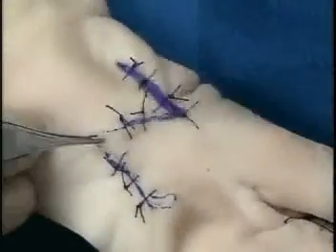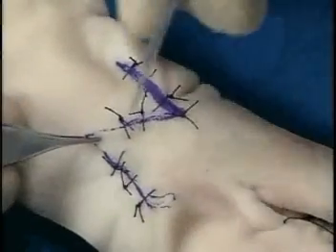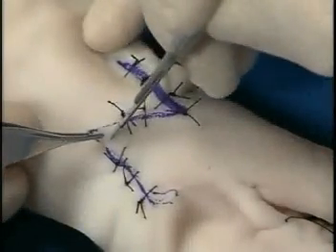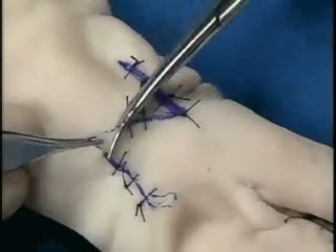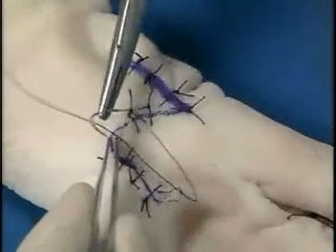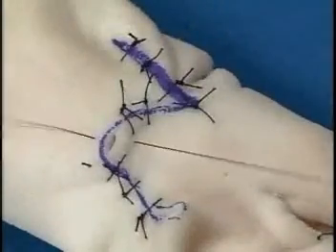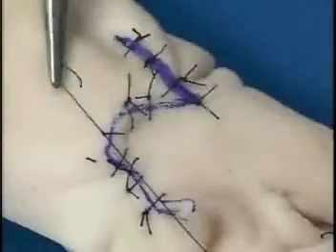Now we can see that there is this excess. We now will cut this triangular excess off so that the flap will inset nicely into the region of the defect. This can be trimmed off with either a pair of scissors or with a 15 blade. And now the final stitch is put into position to close the wound, and the flap is now nicely in position, closing the defect.